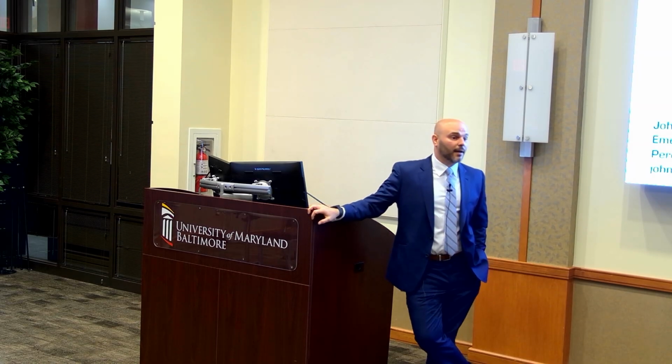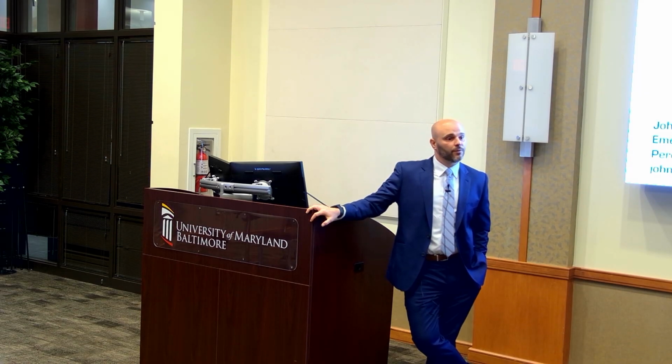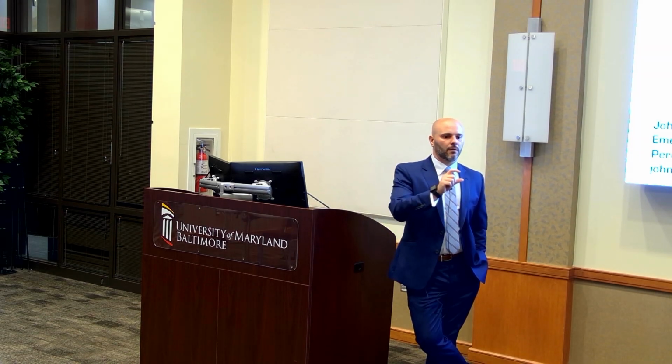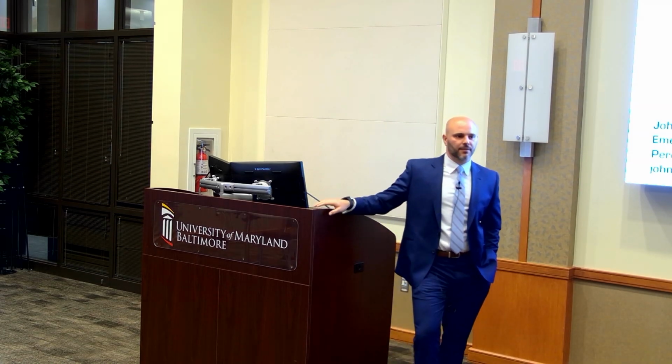And I'm not going to lie, early on in my training, I wasn't using it very much. So as I've gotten out, I want to use it more and more to confirm tube placement. Is it expensive? I don't think it's very expensive. I think it's mostly plastic and then the sensor. I don't think it's very expensive to do.